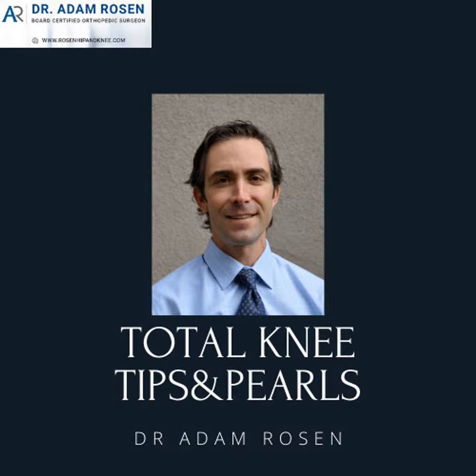And then I always address the femur. If it is extremely tight, you can remove the poly first. Once I remove the femur, then I assess the tibia, then I remove the tibia. And don't chase the cement that you see all over the bone. Wait until you make your bone cuts. But then I will address the cement in the tibial canal.